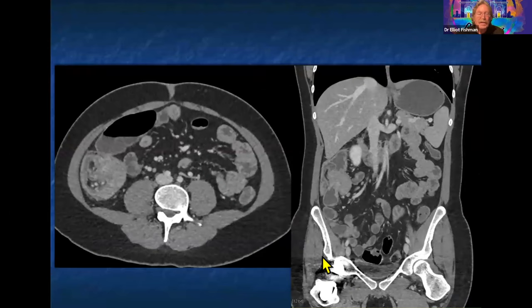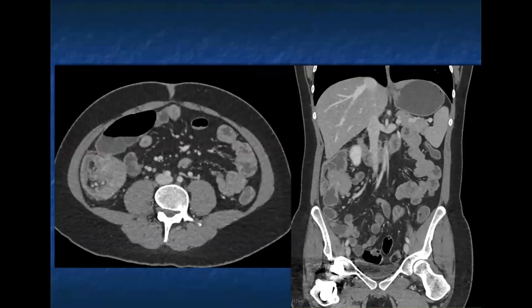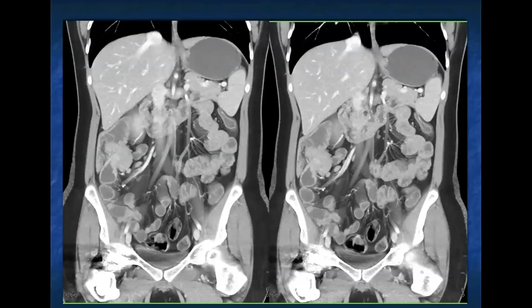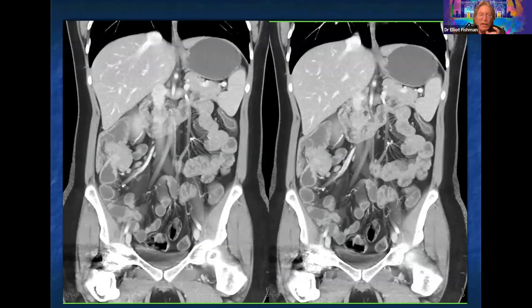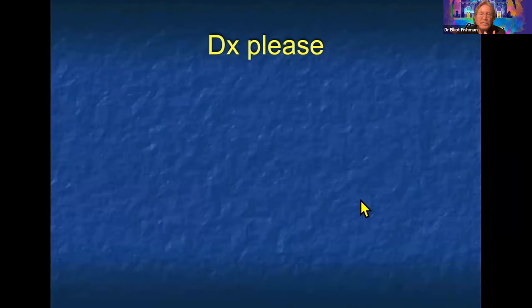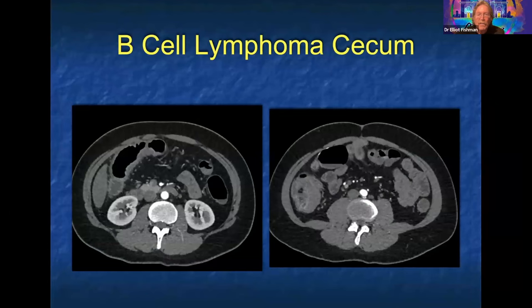Patient with abdominal pain and low hematocrit. Answers: angiodysplasia, AML, adenocarcinoma, intussusception, colonic carcinoma, cecal mass with intussusception. Whenever I see colon and small bowel involvement — although adenocarcinoma of the cecum can grow into the bowel — with those extra nodes present, I always think about lymphoma. This was B-cell lymphoma of the cecum.